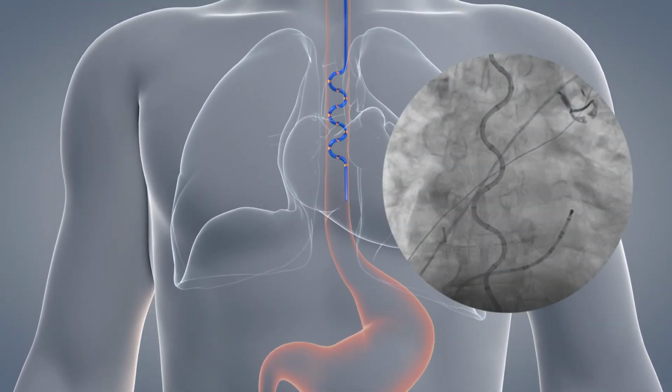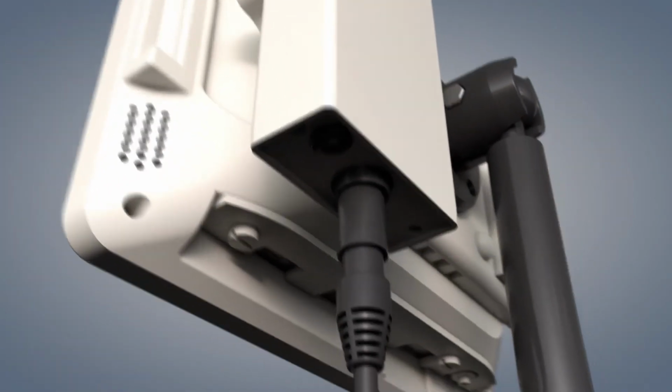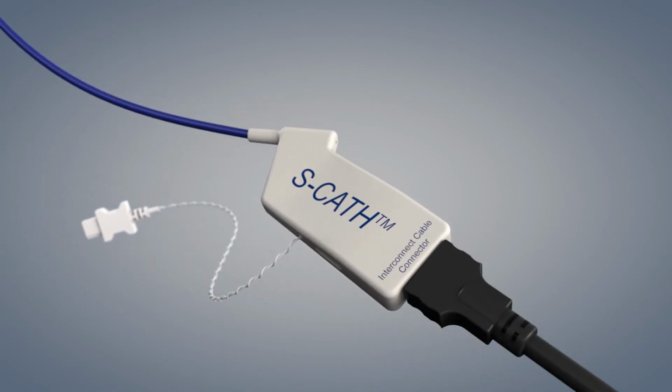Once the probe is properly positioned, connect the CIRCA interconnect cable to the CIRCA monitor. Then connect the probe to the cable. Secure the cable to prevent movement of the probe. You may also connect the 400 series connector to your own core body temperature monitoring system.